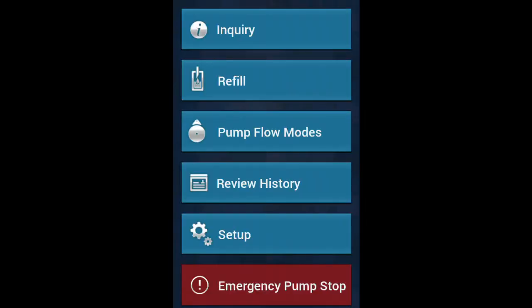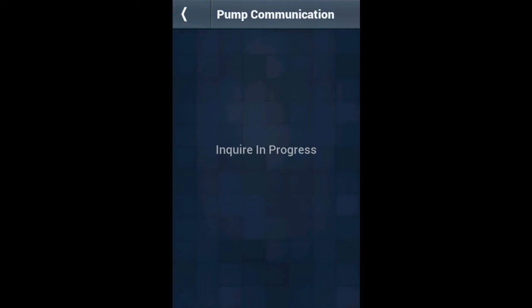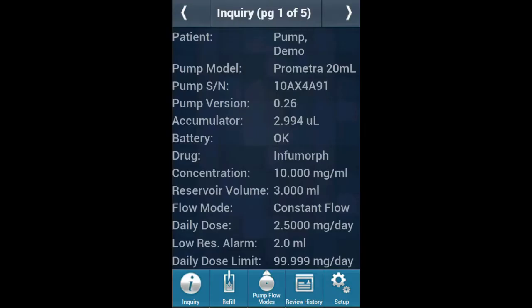After the programmer powers on, click on Inquiry and place the programmer over the pump. After the inquiry is completed, you can find the refill button second from the top on the home screen. If you are not in the home screen, the refill button can be found second from the left in the submenu at the bottom of the screen.